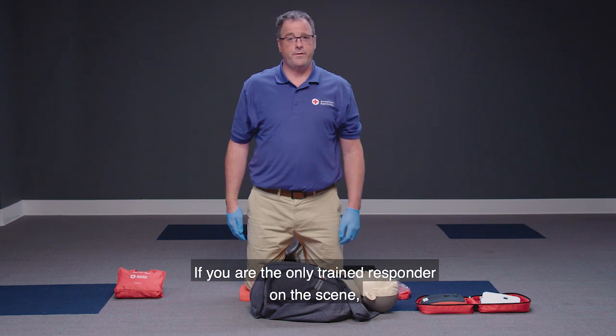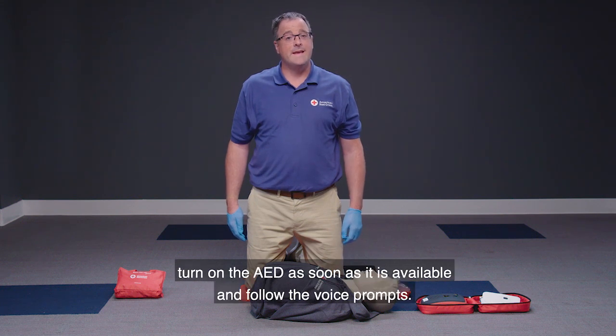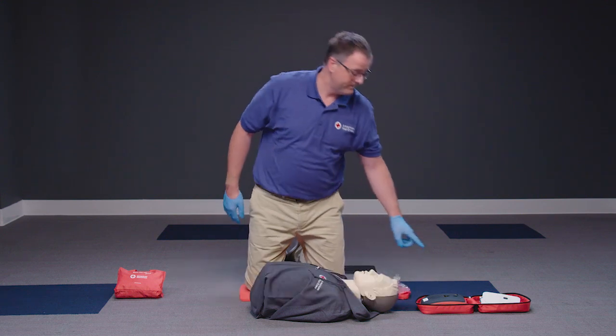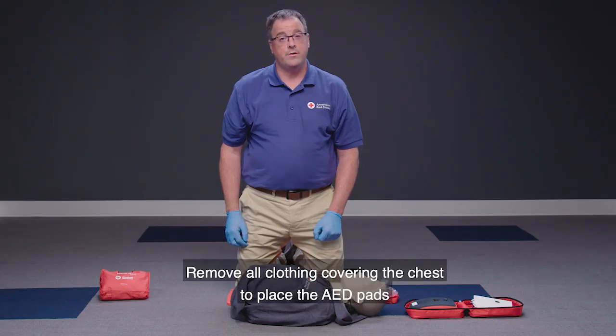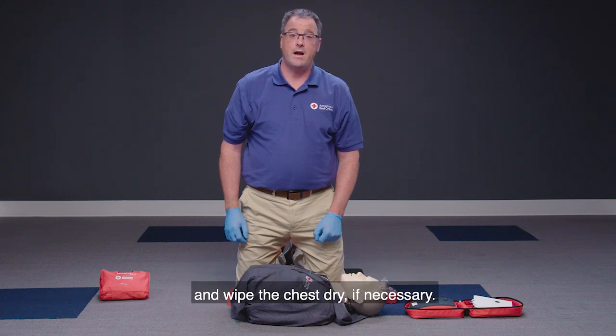If you are the only trained responder on the scene, turn on the AED as soon as it is available and follow the voice prompts. Attach pads firmly to the person's bare chest as shown. Remove all clothing covering the chest to place the AED pads, and wipe the chest dry if necessary.